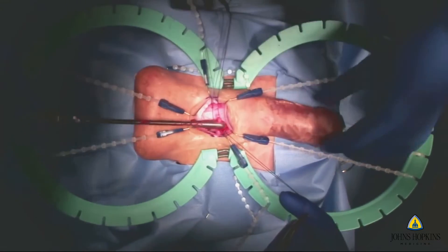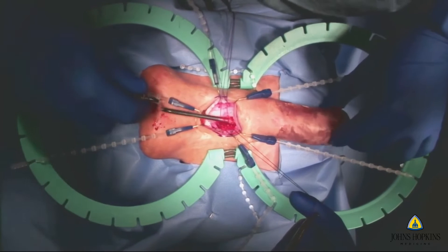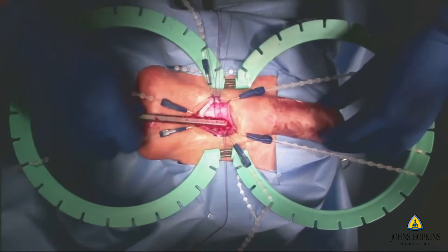Here is the dilatation being performed. As you can see, it's being performed in a very delicate manner, feeling the tip of the glans to know that it has reached its extent. And then here you're measuring the prosthesis that you're placing.